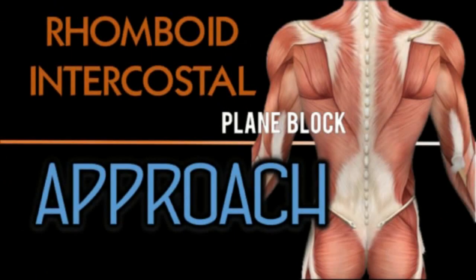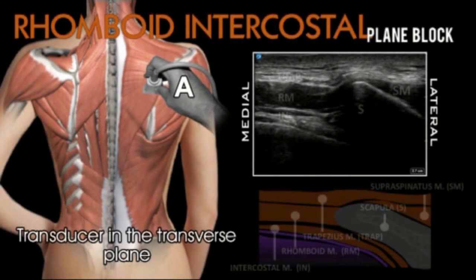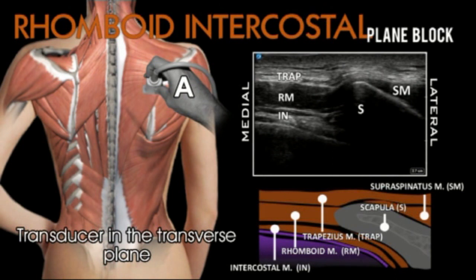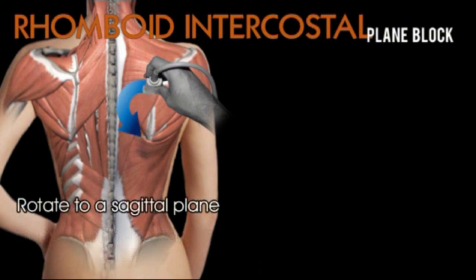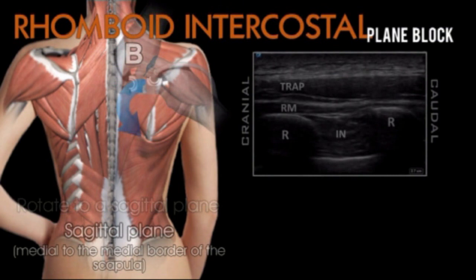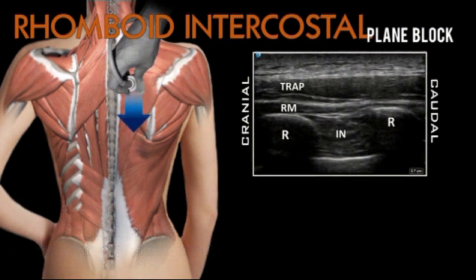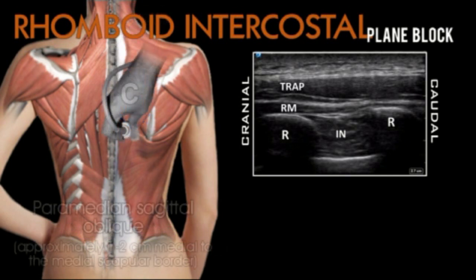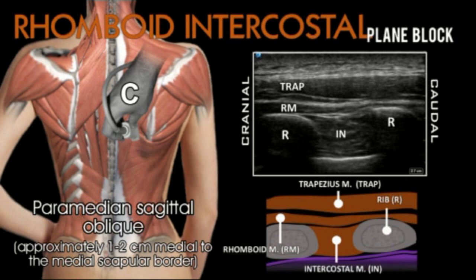Place a linear transducer in the transverse orientation over the medial border of the scapula. Identify the trapezius, rhomboid, and intercostal muscles. Then rotate the ultrasound probe 90 degrees to the sagittal plane and identify the tissue plane between the rhomboid, intercostal muscles, and the ribs.